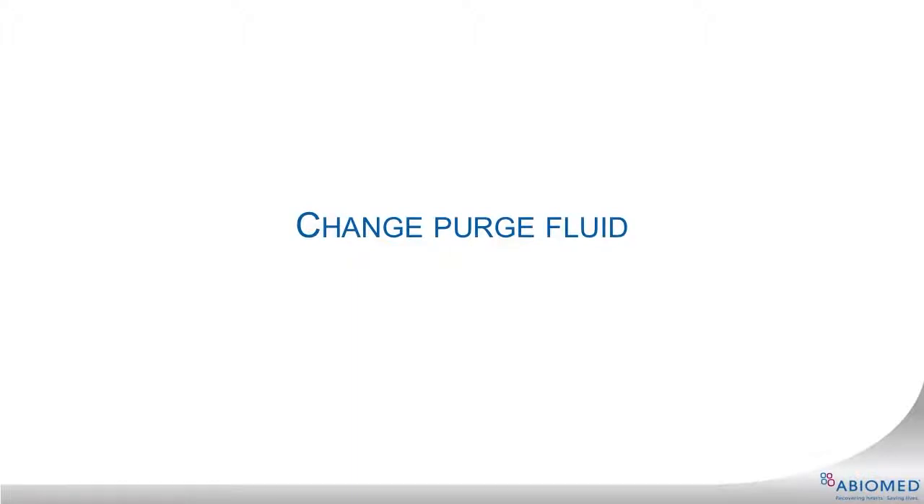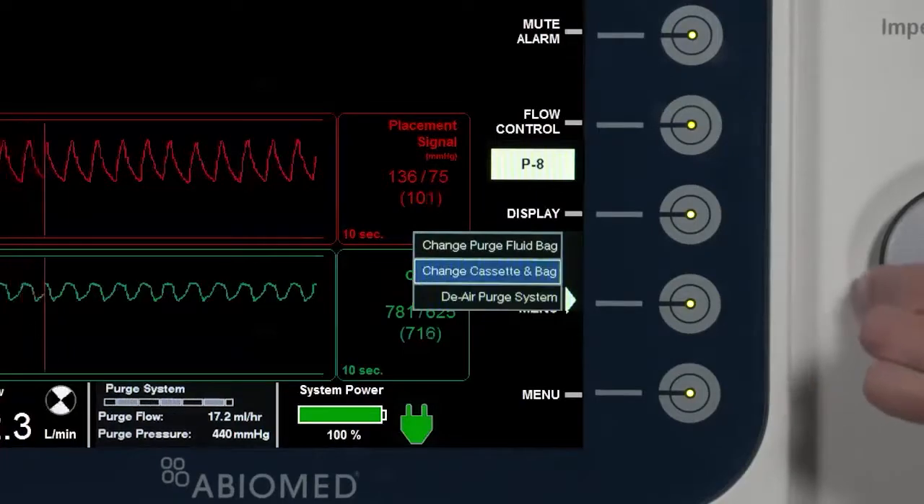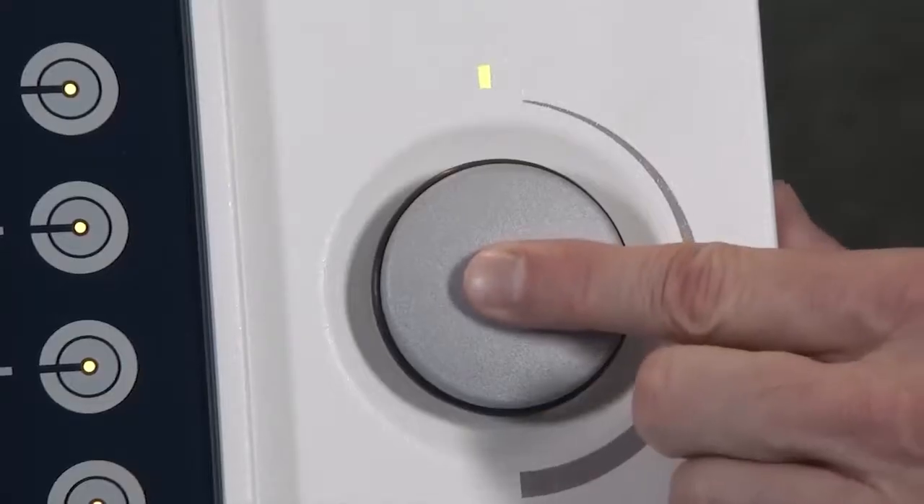To begin the Change Purge Fluid Bag procedure, select the Purge menu soft button. Use the selector knob to scroll to Change Fluid Bag and press in on the selector knob.